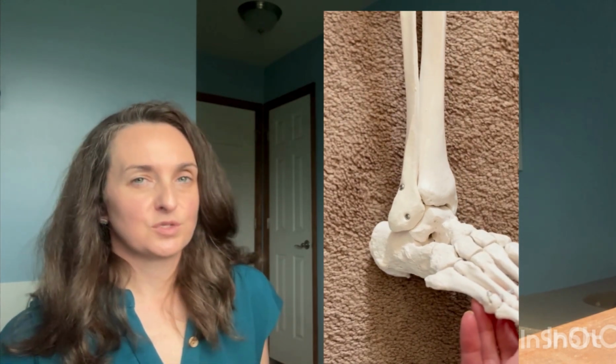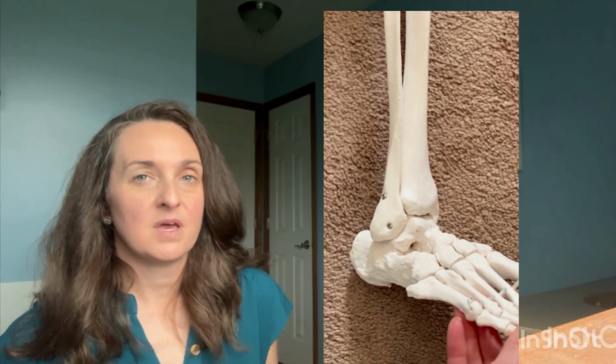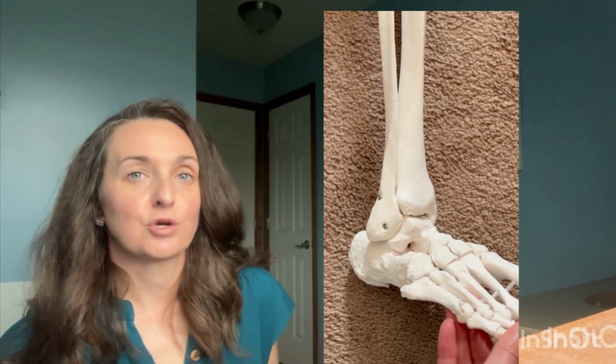If you rotate the ankle more than 20 degrees internally, then you'll notice that both the distal tibiofibular joint and the lateral Mortise will be open, but the medial Mortise will appear closed. As a student, focus on rotating the entire leg, not just the foot. That small adjustment often makes the difference between a repeat image and a perfect Mortise view.